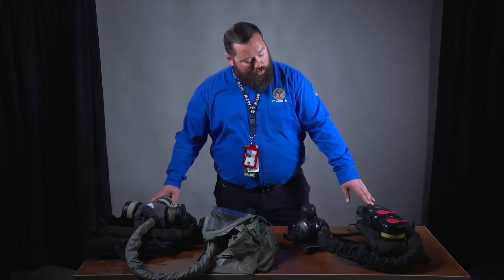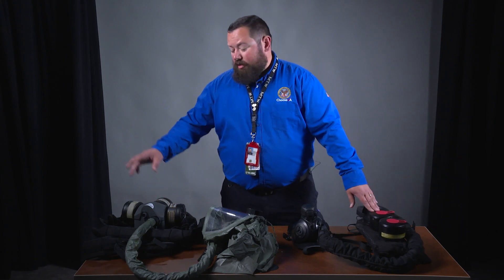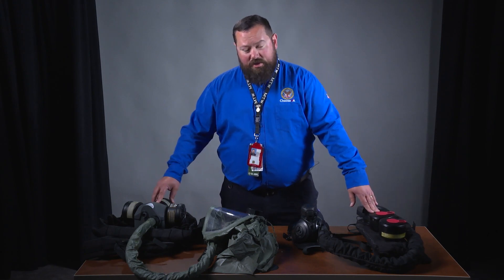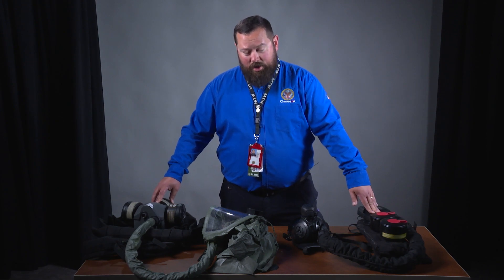Both units have canister filters. The MPPAPR has two, the Dover Sentinel XL has three. This does not impact their ability to provide protected, cleaned air for the wearer.